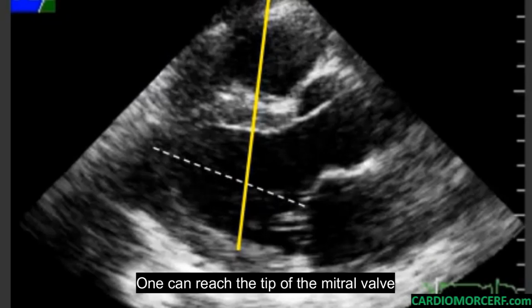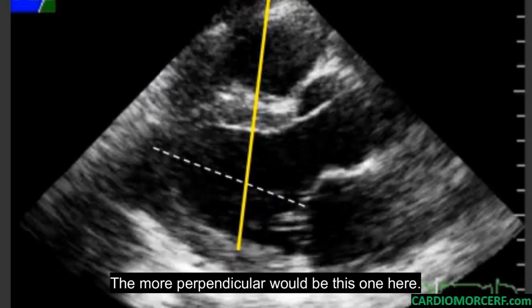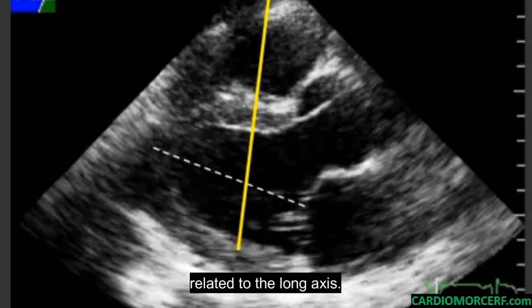One can reach the tip of the mitral valve or the region of the chords using several different angles that would result in values other than the perpendicular one. Except by knowing where the long axis is, in this image, for instance, the more perpendicular would be this one here. Most of the time it's not perpendicular, but we have to try to define the best angle related to the long axis.